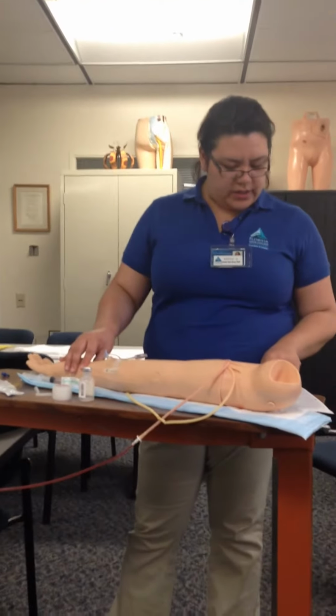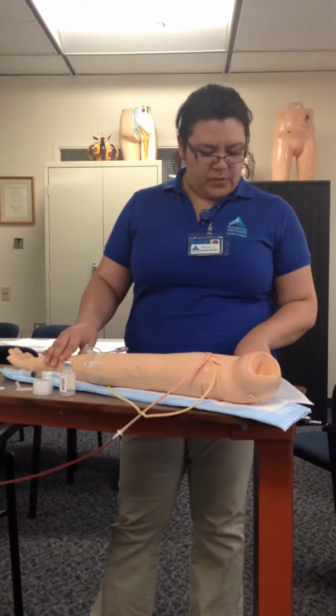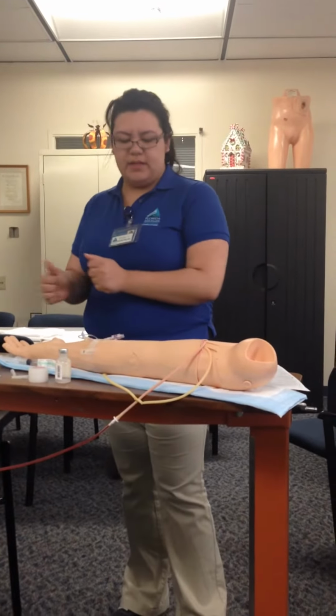So now I will wash my hands, and I'm going to apply clean gloves.